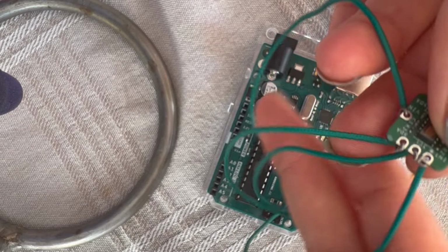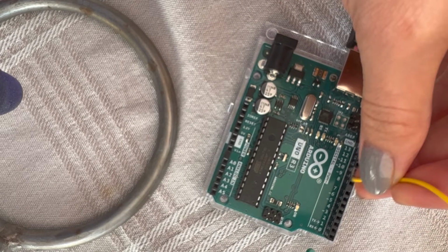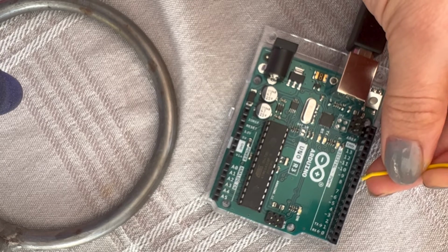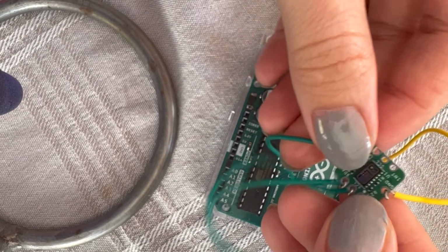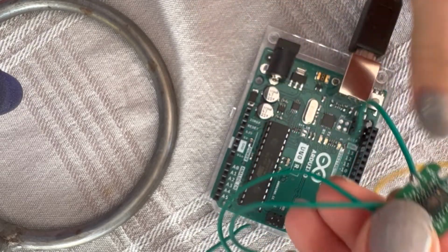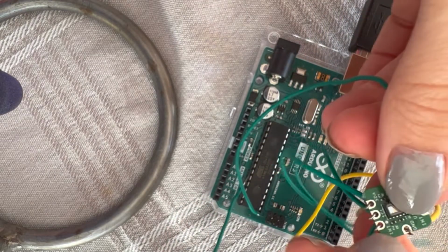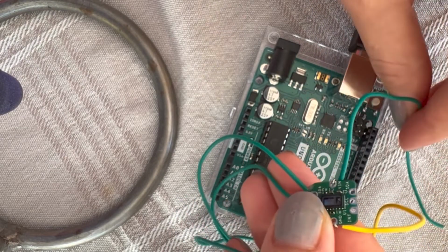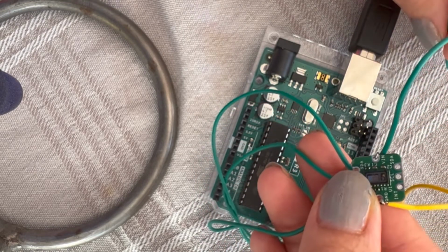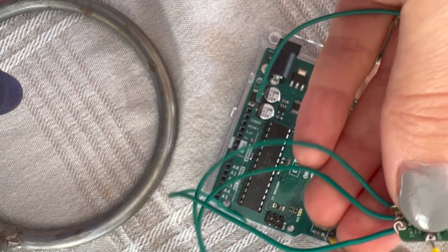So I'll just go ahead and connect this. This is our first task, to just make this connected and work. I'm filming on my phone, so hopefully you see it. And this one is number 10. Okay, the ground. Oh no, sorry. What am I doing? Should be this way. No, let's make it this way. I didn't have so many different wires because I use lots of them on the LCD as well, so they're of the same color, but I hope it makes sense.